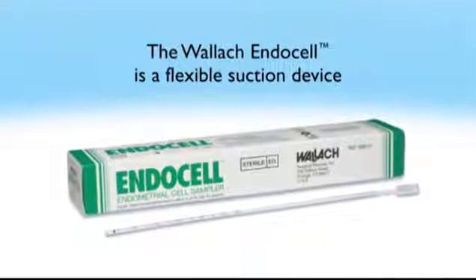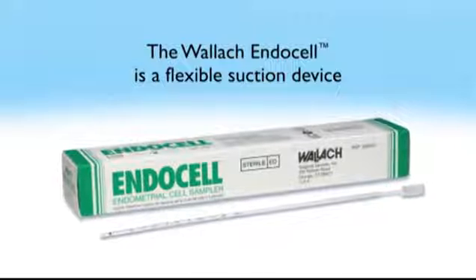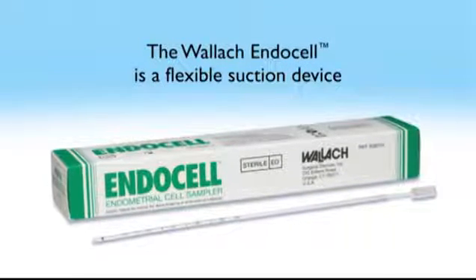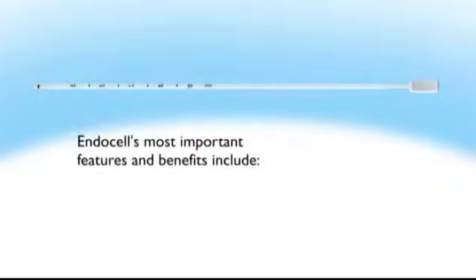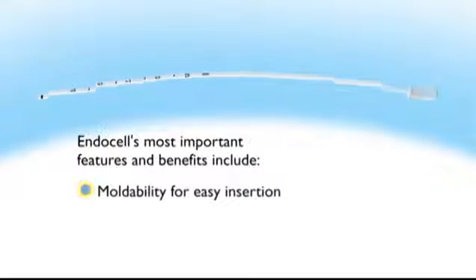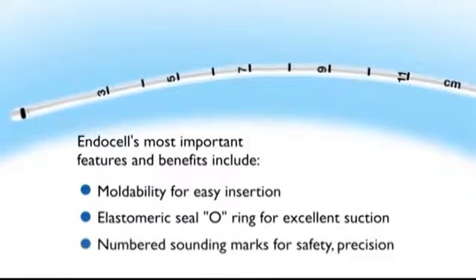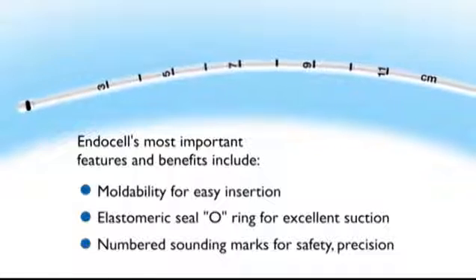The Wallach Endocell does not require anesthesia or hospitalization. The Endocell's most important features and benefits include moldability for easy insertion, an elastomeric seal o-ring for excellent suction, and numbered sounding marks for safety and precision.